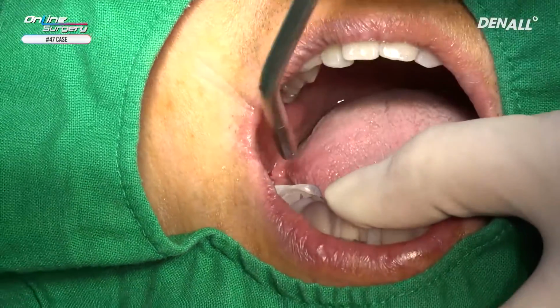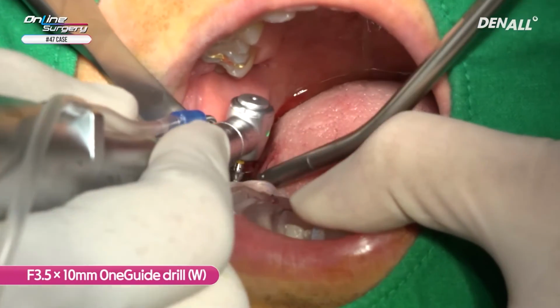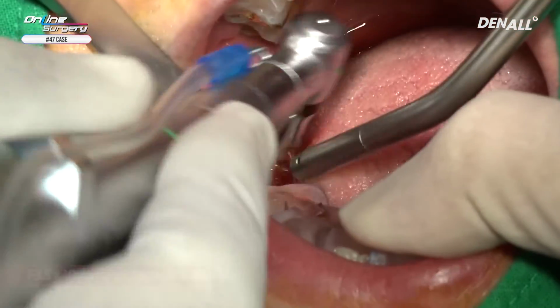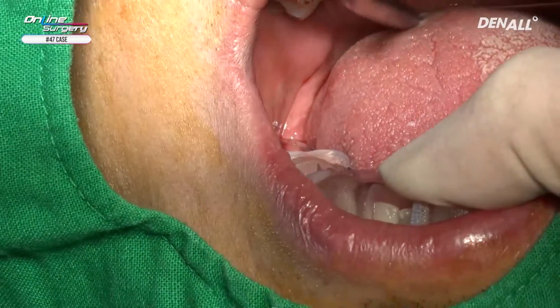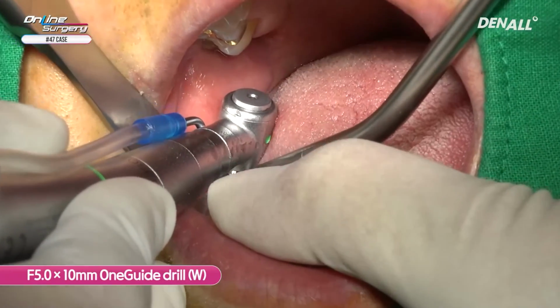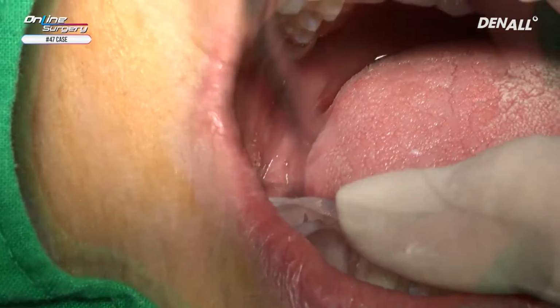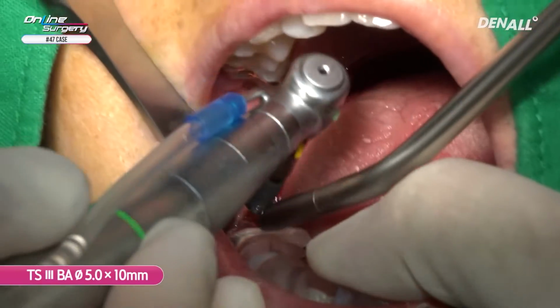Close slightly. Open wider, please. Open wider. Open wider, please.